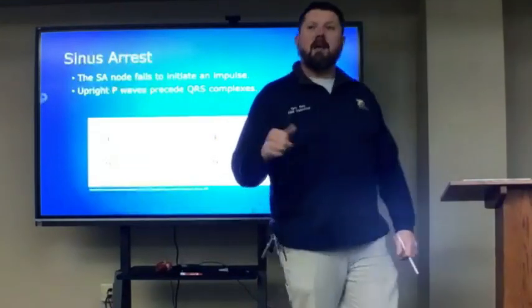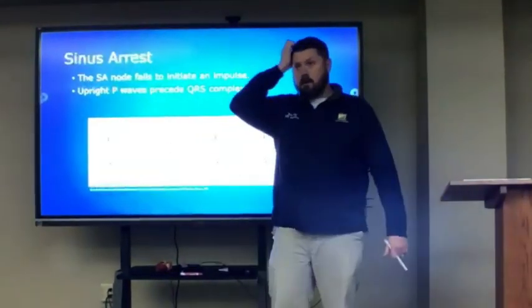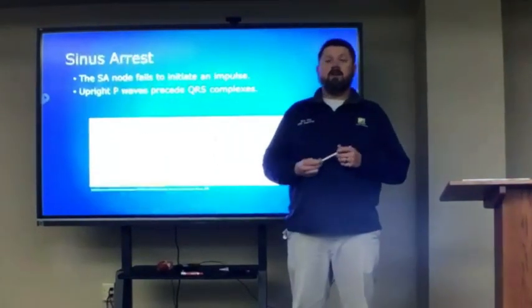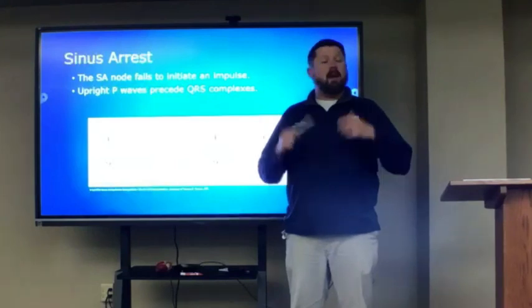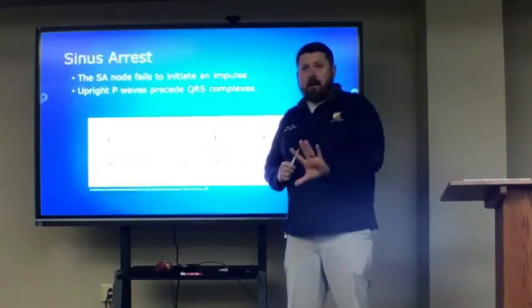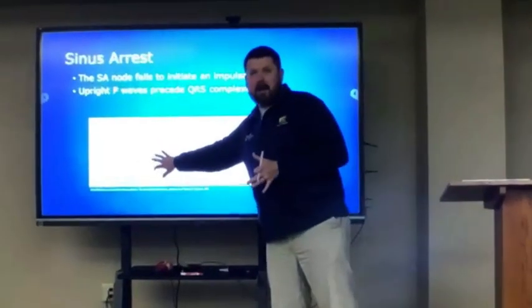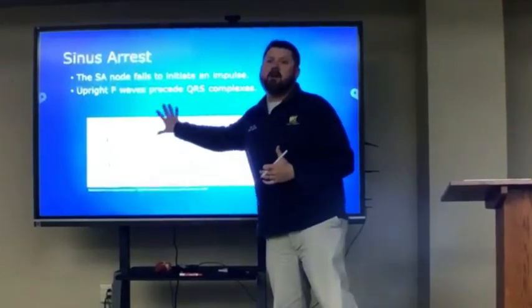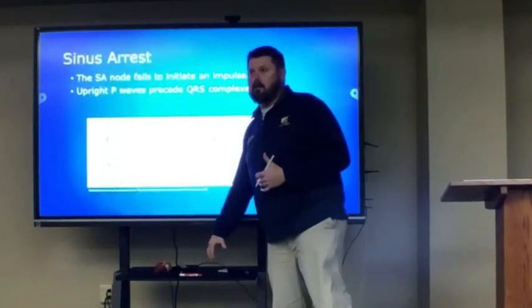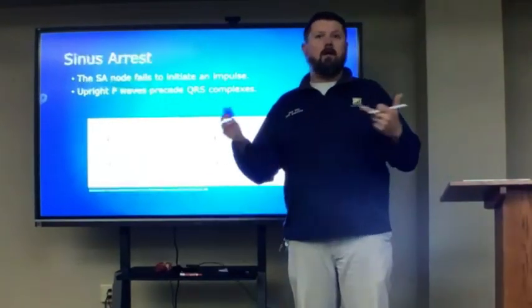Now, why don't you see anything ventricular in this aspect? What do the ventricles depend on in order to contract? The SA node. I know that the ventricles can start pacing on their own, but in this short of time right here, they haven't really gotten the message, right? So that's why you're not going to see a ventricular conduction here. Now, you give it a few more and the ventricles don't get conducted, then they're going to say, hey, we need to start doing something. Okay?